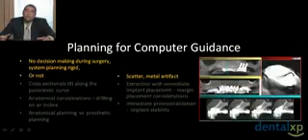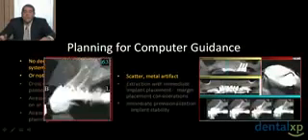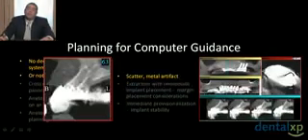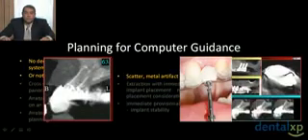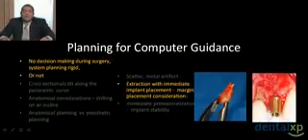Sometimes we're going to find images that have scatter and metal artifact caused by crowns or adjacent metallic restorations. And although we may look at our alveolus and be able to accurately interpret that, when it comes to where this tooth really ends or where the alveolus really starts, that becomes difficult to interpret. And so we may want to use a system that allows us to make changes at the time of surgery, so that we can have our general guidance from that position, but we can make some final decisions at the surgical site.